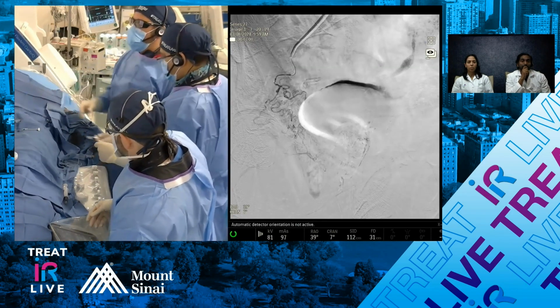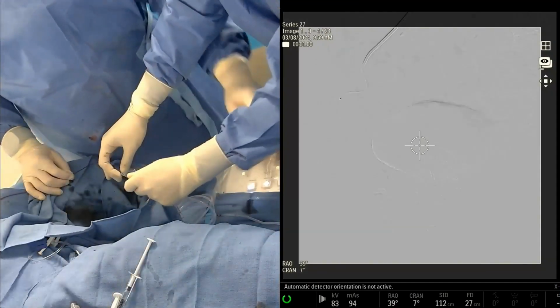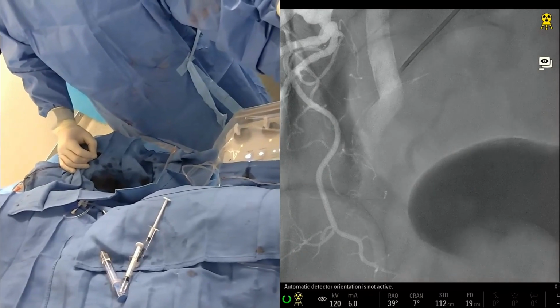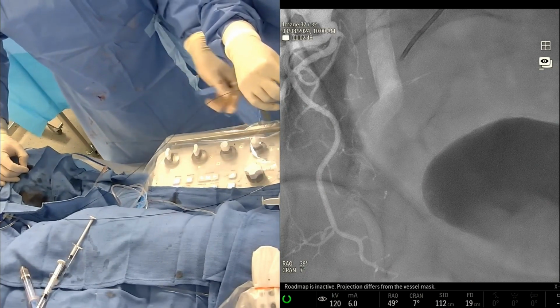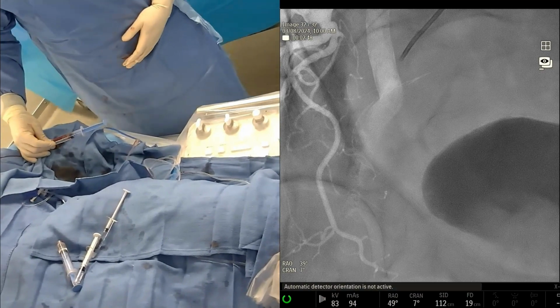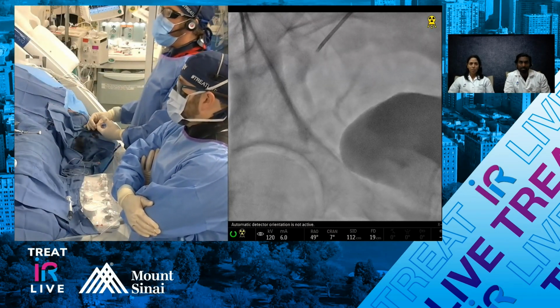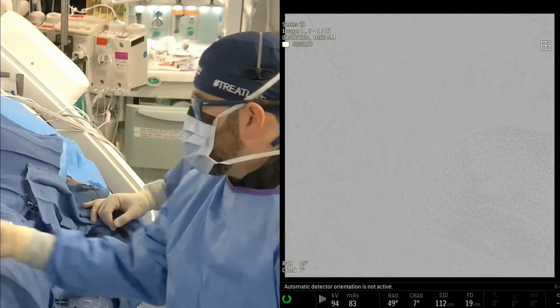It's probably better to go steeper, and then we'll take a better look zoomed in. I think we're going to do another run, especially for everybody that's watching, because people want to see the origin in better detail. The type 1 origin, obviously the steeper angle is going to really show you that more anterior side of the anterior division and open it up. I'm going to go real steep here, 50. We probably have five or ten minutes here, just keep five minutes to do this. You can see it there. All right, let's go.